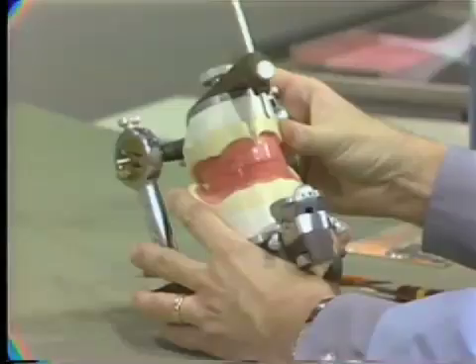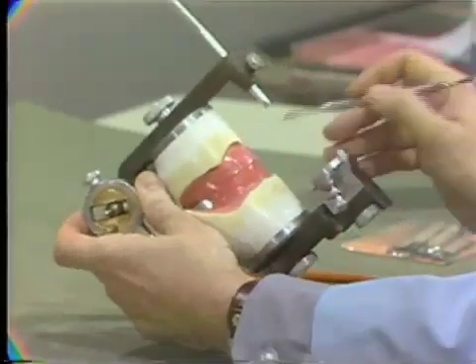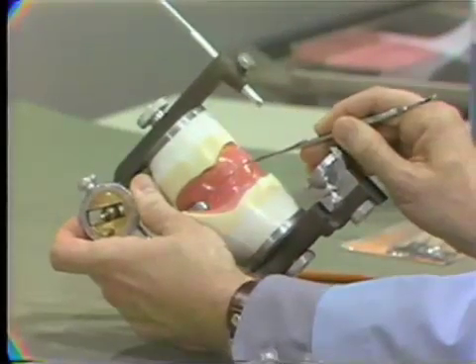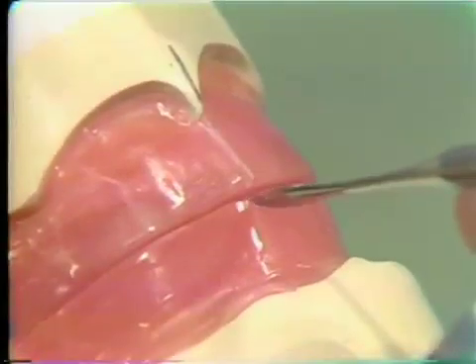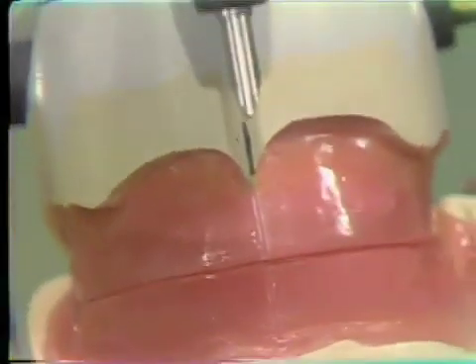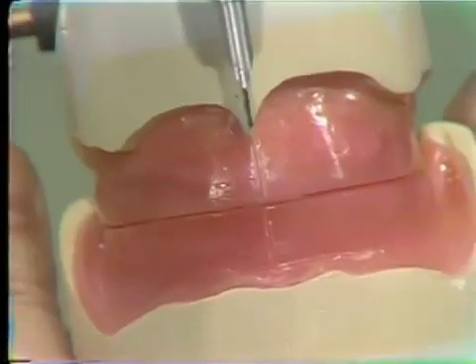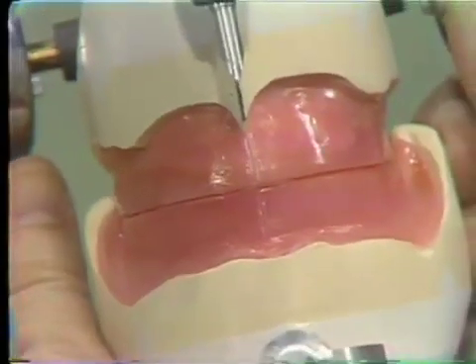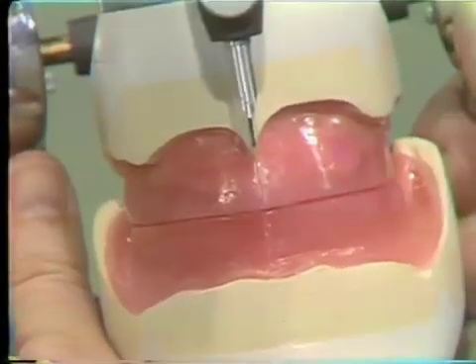Now, the next logical step, of course, is to go to the mandibular. So we'll just keep that line going and line up another mark on the lower wax occlusal rim. So now we've scribed a line which shows the midline of this particular case for anterior tooth setting. That's the first step. And don't forget to put it on the cast because the wax is removed as we set the teeth and we don't want to lose the midline as we set these anterior teeth.